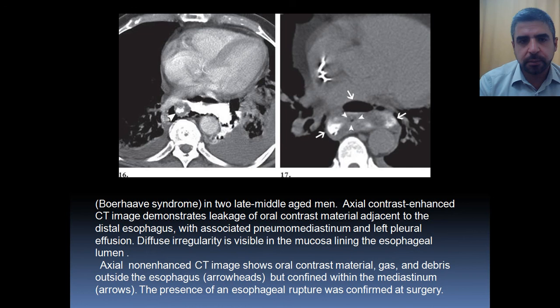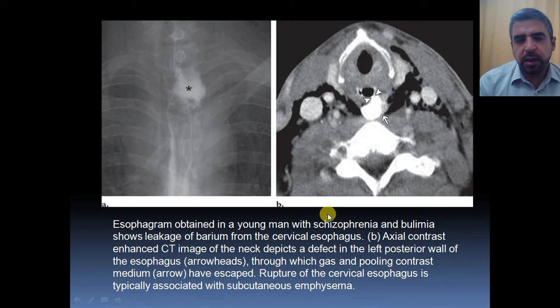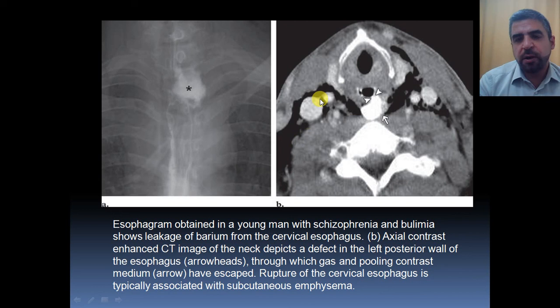Again, you can see here a case of a schizophrenia patient with bulimia. There is evidence of contrast leak from the posterior wall of the hypopharynx and the upper esophagus. There is a large amount of subcutaneous emphysema resulting in crepitus between the soft tissues of the neck, and on swallow studies there is obviously a contrast leak from the esophagus.